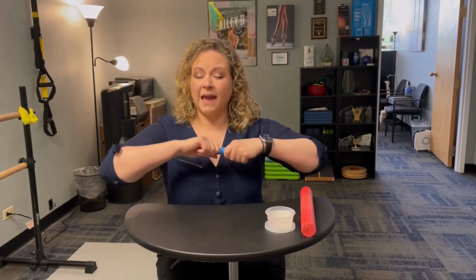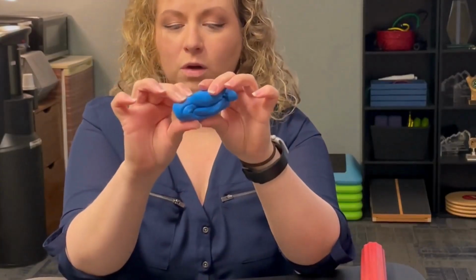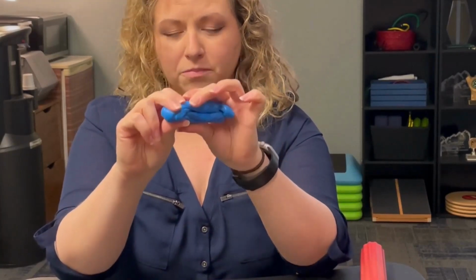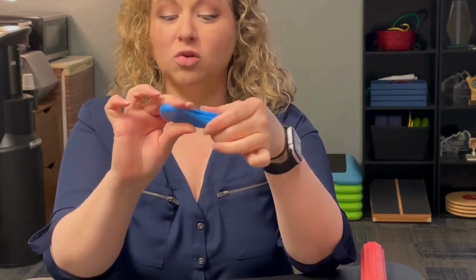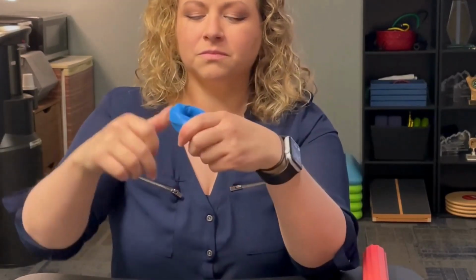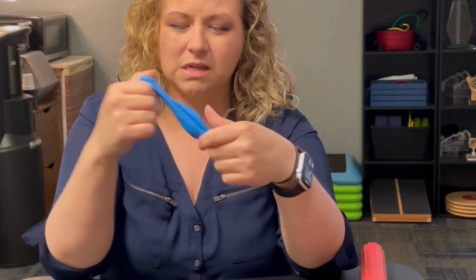To get into the hand a little bit more here, we can work on different types of pinches. So here, I can work on pinching between my 2 fingers and thumb. This is called a pincer grip. I can just pinch. I can pinch and twist. I can do, it's called a key grip, so it's like you're holding a key for the door. So I can pinch in that direction and do twisting or just gripping and that sort of thing.